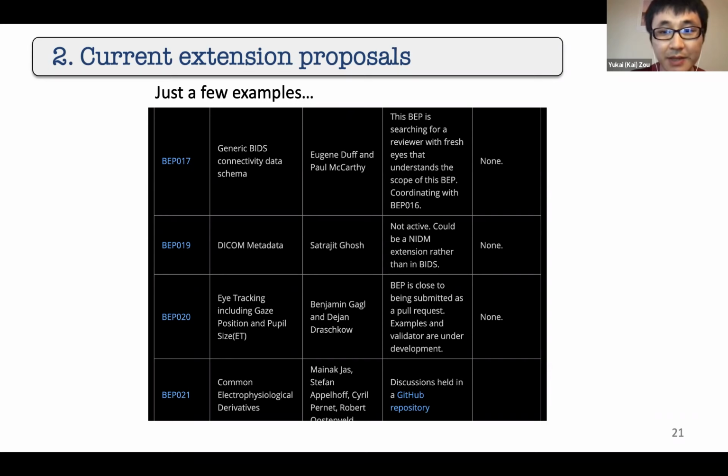Sometimes there's some metadata missing there, which complicates running BIDS. So there are actually some data that is not passing the BIDS pipeline. We want to run BIDS, but we have to fix something earlier because of the anonymization in the clinical setting. So is the BIDS community aware of this problem, and maybe it can be addressed within the BIDS framework?